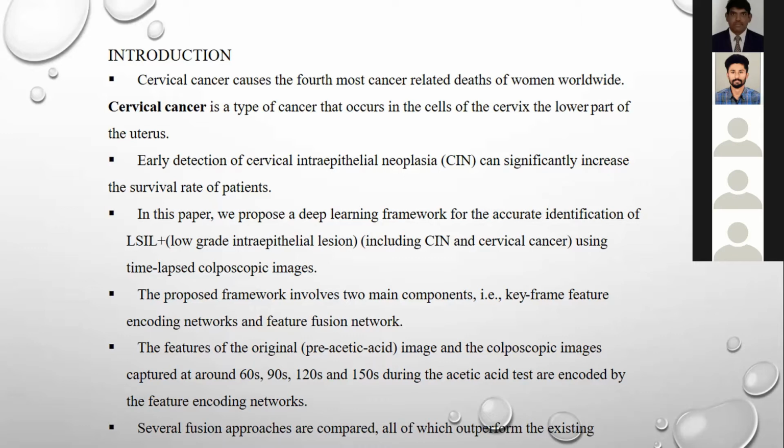The proposed framework involves two main components: a key frame feature encoding network and a feature fusion network. The features of the original image and the colposcopic images captured at around 60, 90, 120 and 150 seconds during the acetic acid test are encoded by the feature encoding network.